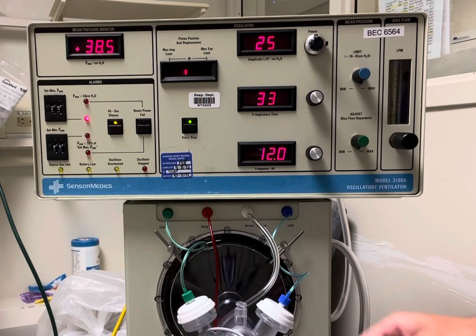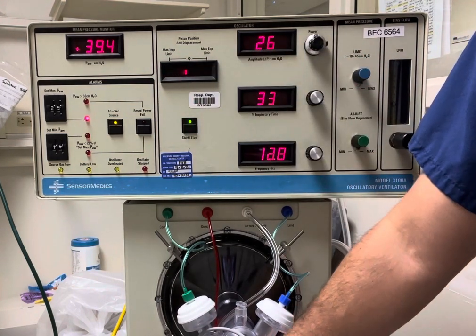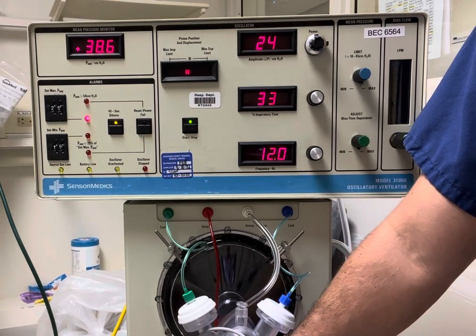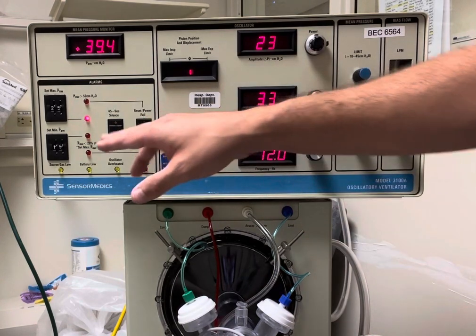There is a piston knob and it's to ensure that the piston is actually centered. I'm actually trying to center it right now, as centered as possible. And then from there we go about the settings.